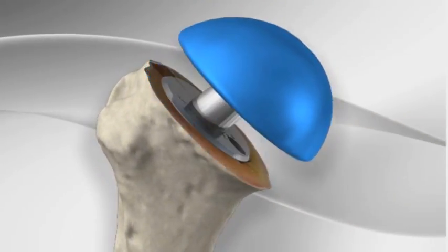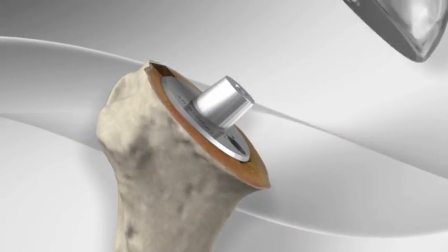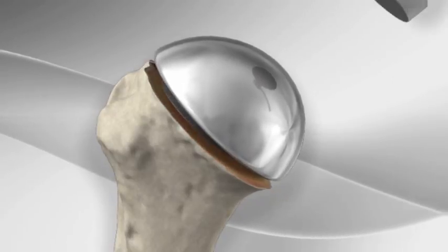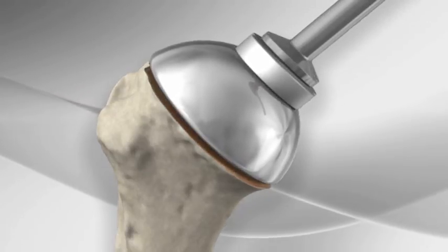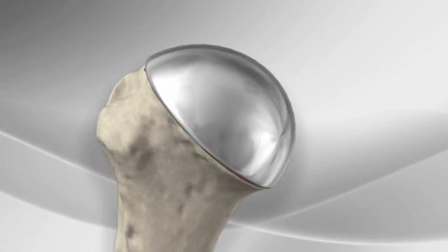If the surgeon is satisfied with the performance of the trial implant, the final implant head is then impacted into the shaft to replace the surface of the joint and complete the operation.